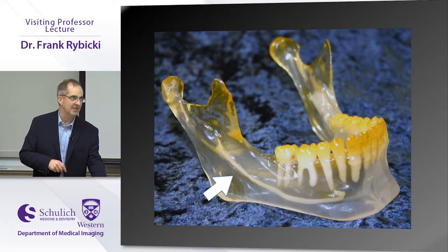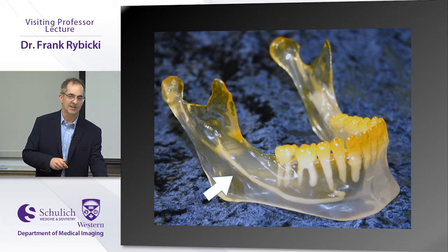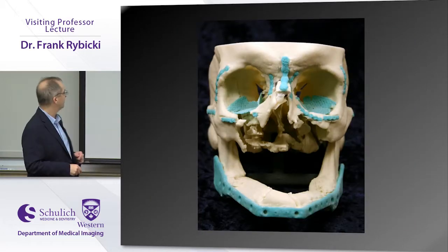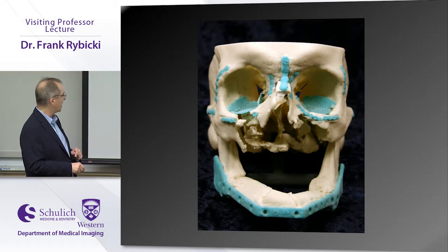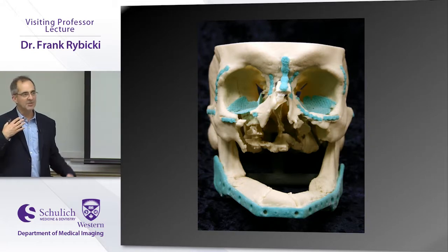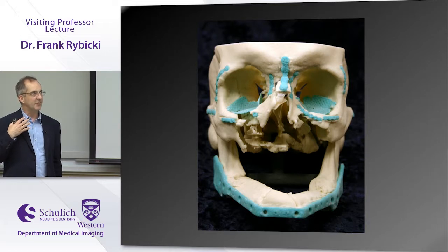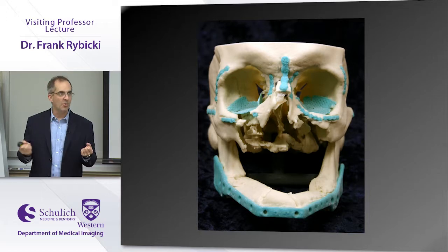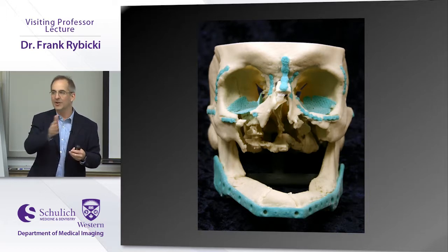There's a huge dental application in 3D printing. I mean, most dental devices right now are 3D printing. I don't even know how many hundreds of millions of dollars the business is, but it's gigantic. All of these devices that you use to actually cut or to remold things, when someone has a bad maxillofacial injury, they take a piece of fibula out and they're bending it in the OR. It takes hours and hours, and then they're figuring out how to cut it.